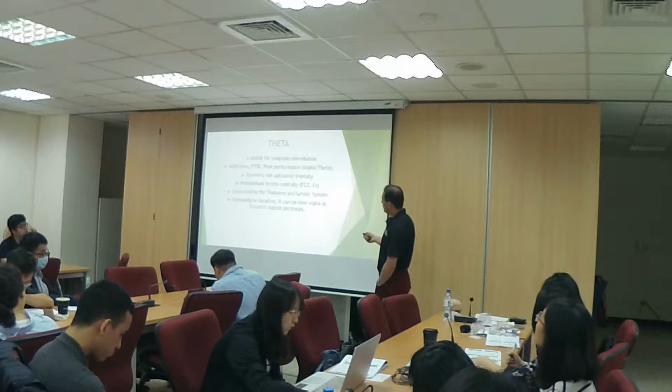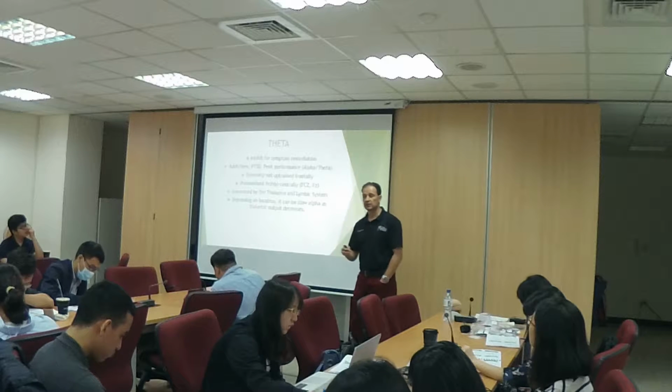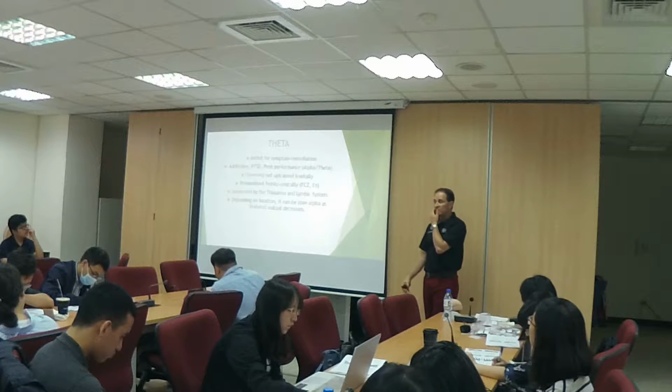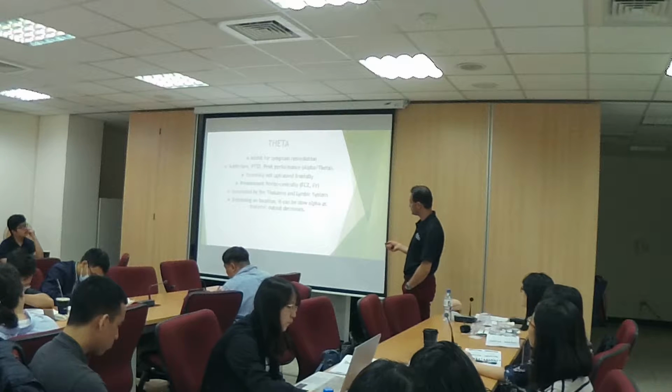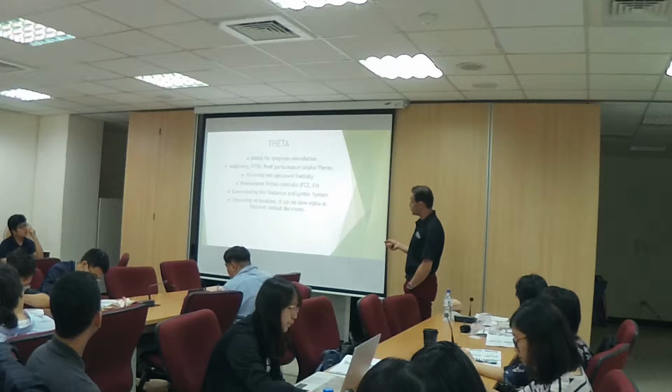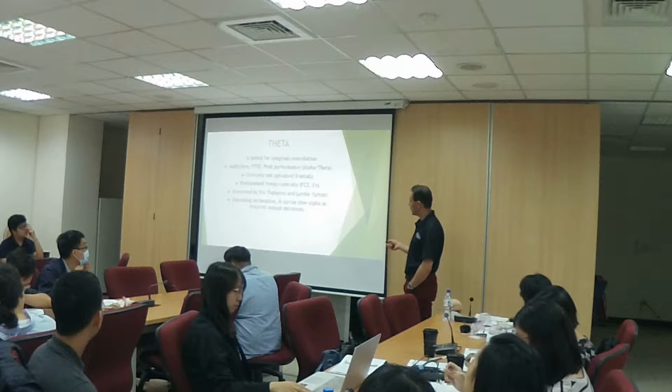So we inhibit it for symptom remediation, whether it is inattentiveness, fogginess, fatigue, whatever it is, we want to inhibit and downtrain it. We use it for addictions, the alpha theta protocols, peak performance, and PTSD.